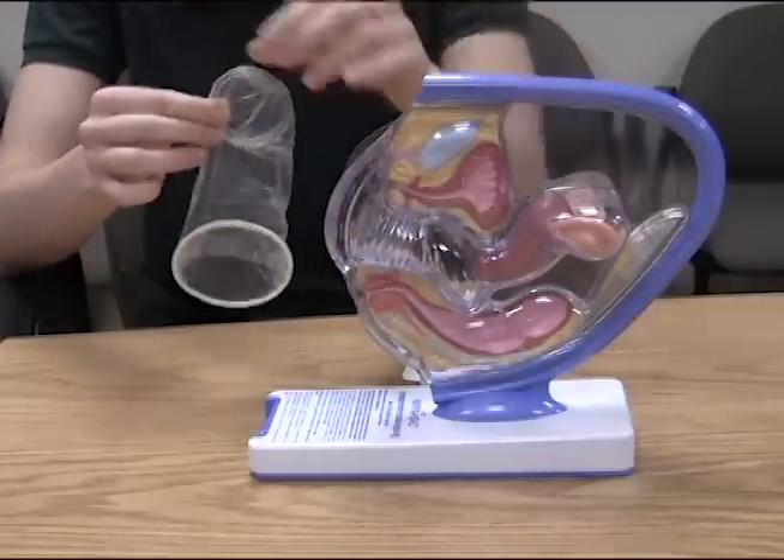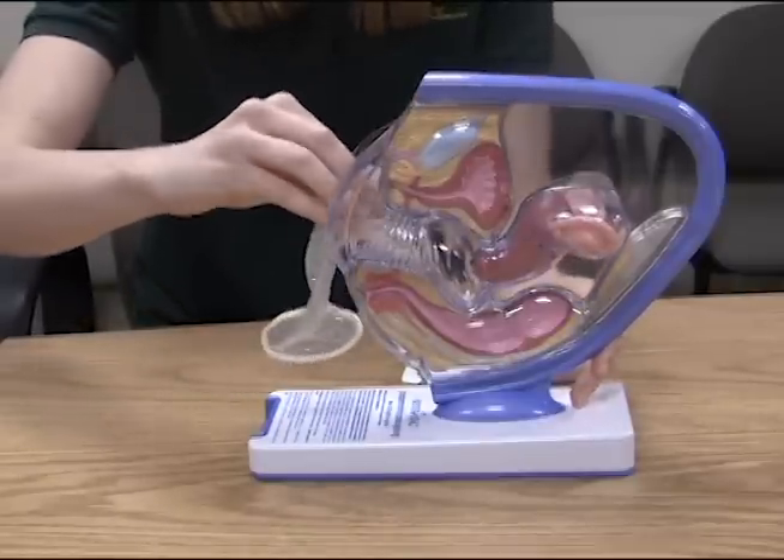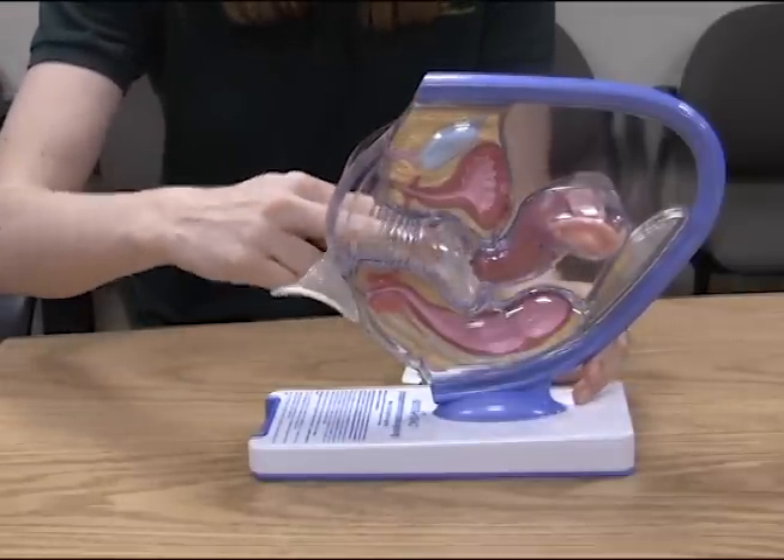Before inserting, there's an elastic ring that you're going to pinch, and then you're going to guide it through the vagina, all the way until it covers the entire cervix.